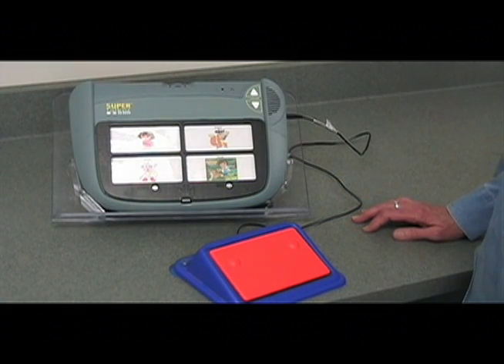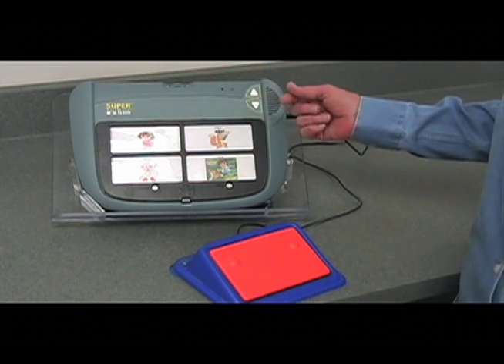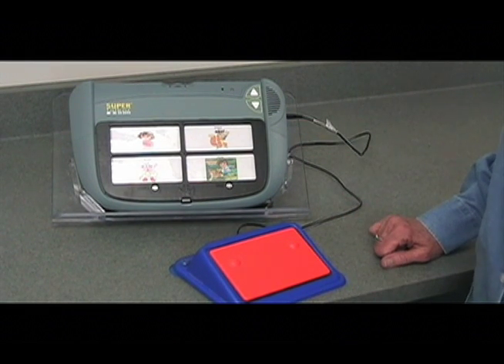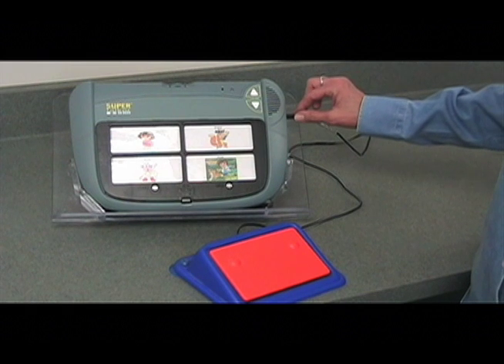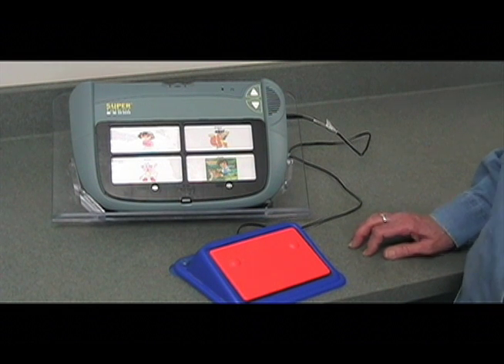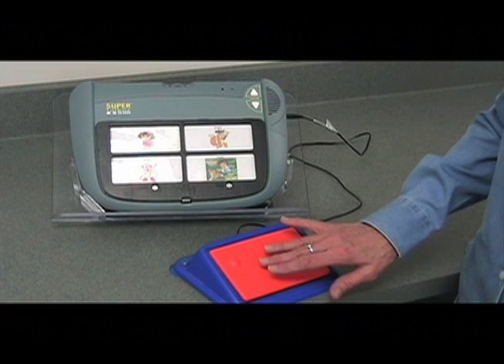The SuperTalker also has a step-ahead function that allows a user to produce all of the messages that are recorded on a given level by repeatedly pushing a switch. This is useful for somebody who cannot reach out and touch the surface of the device. Simply plug a switch into the step-ahead jack, and then the messages will be produced in sequence, starting at the top and going left to right. Let's see how that works.